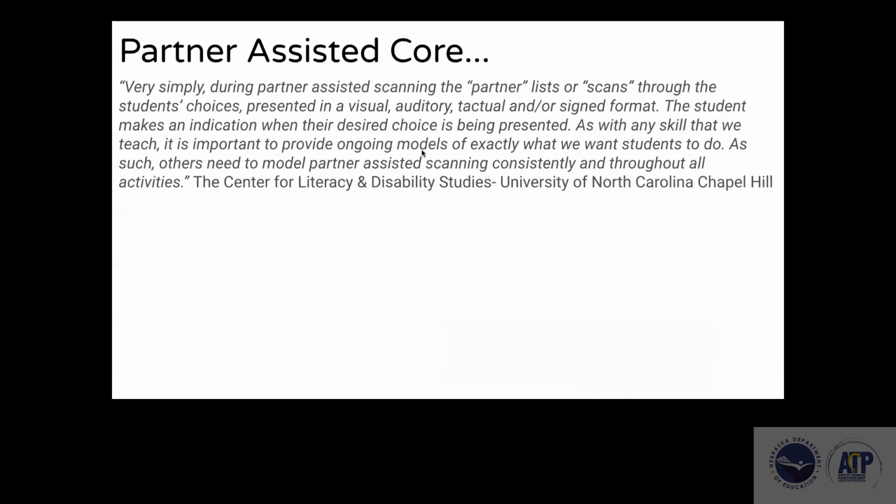And then we have a variety of students that have physical needs, they're young users. We always trial a variety of different access methods, and I'm going to share a few of those in a little bit. But what we've really found is when we're first starting off and they still have not gotten to that access piece, we're always working on access, whether it's switch access. I'll show a variety in a moment.